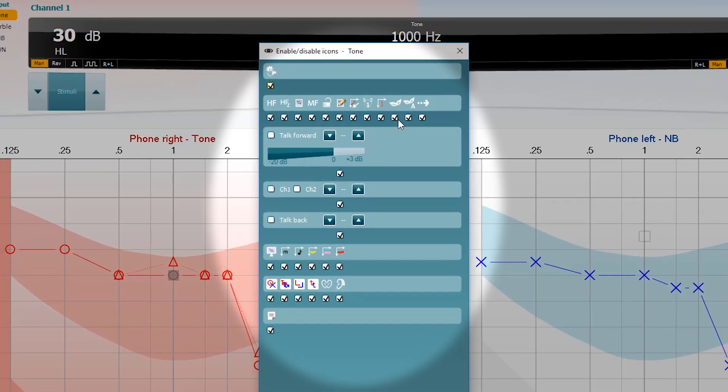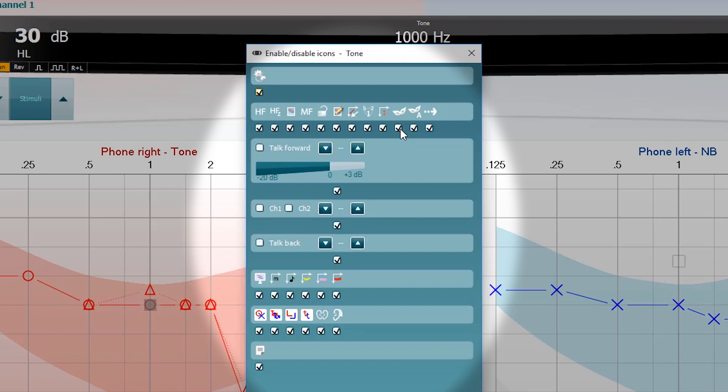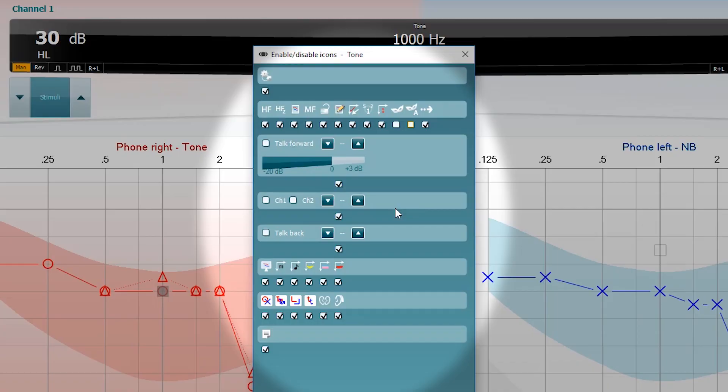For the benefit of this video, everything has been enabled at the start, but if you then want to turn certain features on and off, for example, I don't use the masking helper or auto-masker, and because I'm working in a scenario with my patient where they're sitting side-by-side with me, I can turn off my monitor function and the talkback microphone.